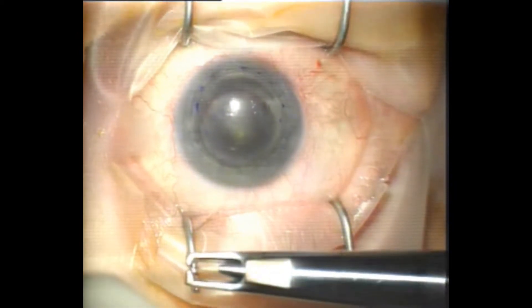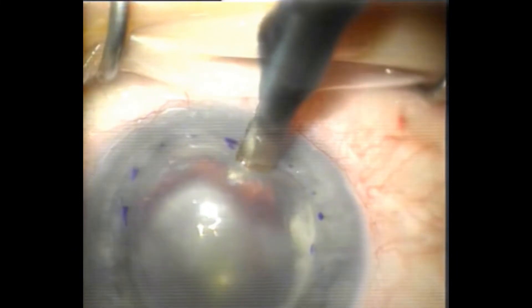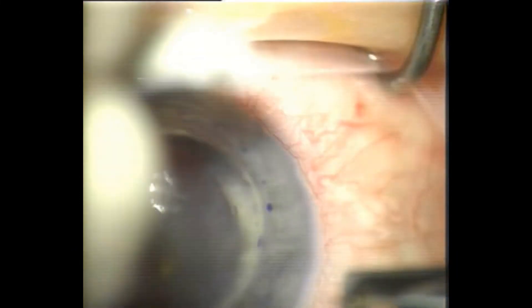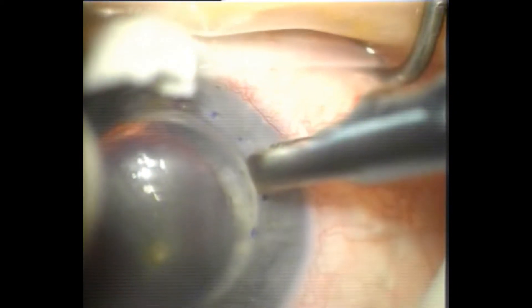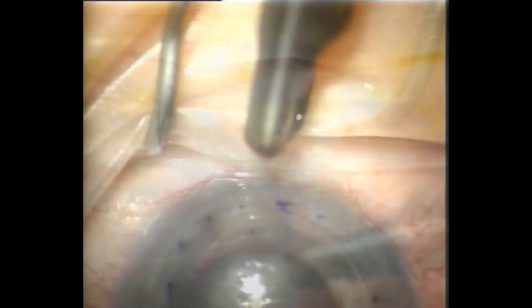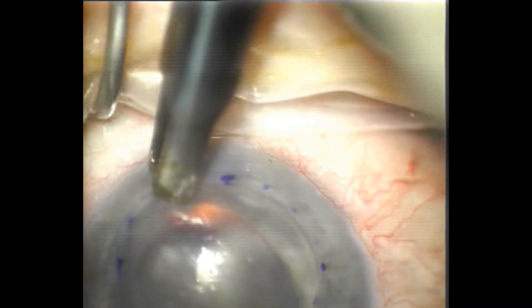I'm using a micrometer diamond knife and I measured the depth to be about 550 microns, so I'm not intending to go full thickness, wanting to preserve the deeper layers if I can. The patient was snoring at this stage, so you'll see the eye moving a bit and I'm just having to move with him. Just doing the first incision, then checking it and just re-deepening now. Sometimes with the diamond knife you need to wiggle it side to side a little bit to find the previous track before making your cut.